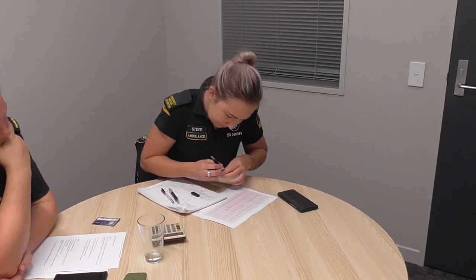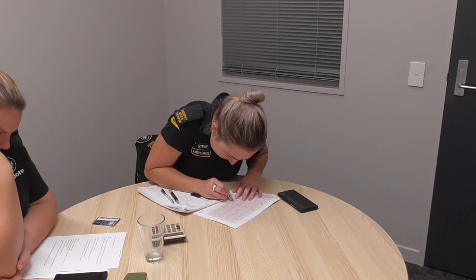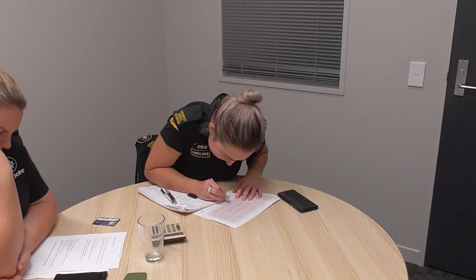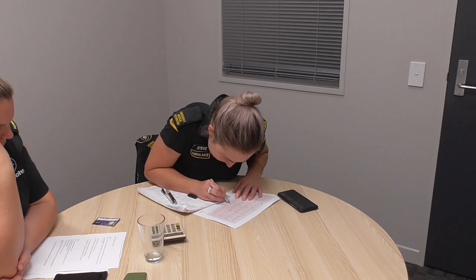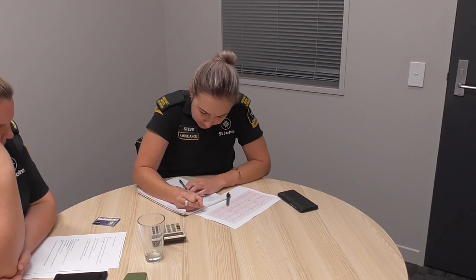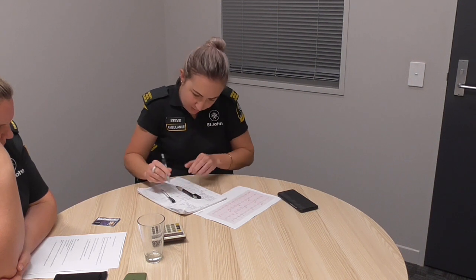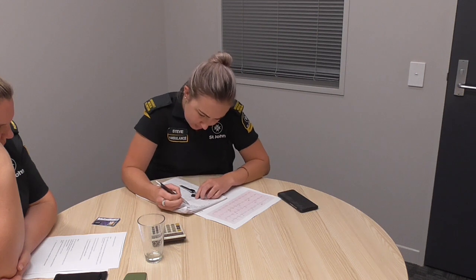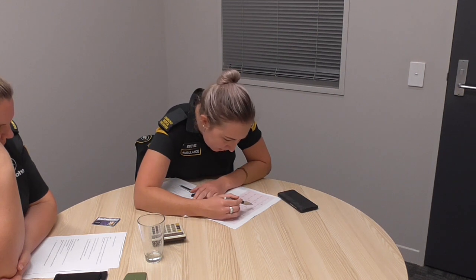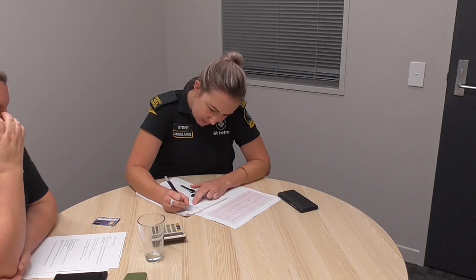PR interval. There's 3 small boxes, so 0.12, which is normal. That rules out any first degree heart blocks. There's a QRS wave for every P wave, which rules out higher order heart blocks.